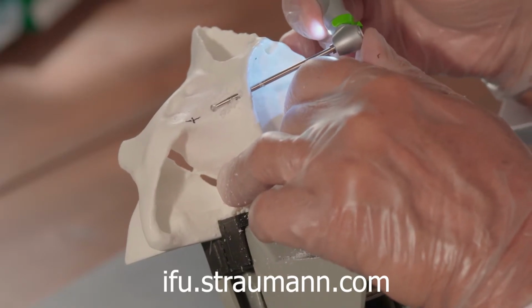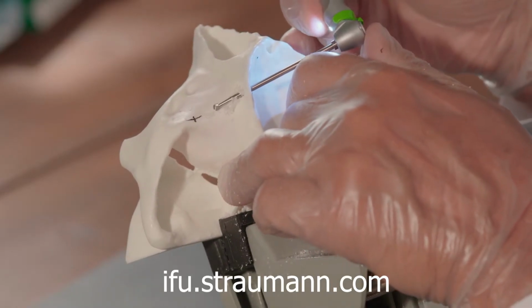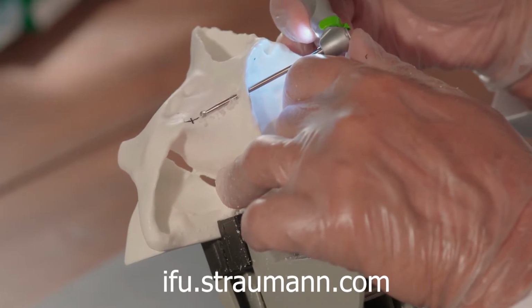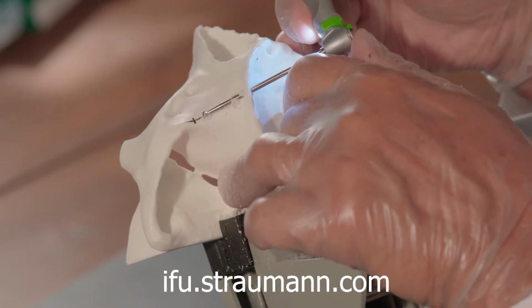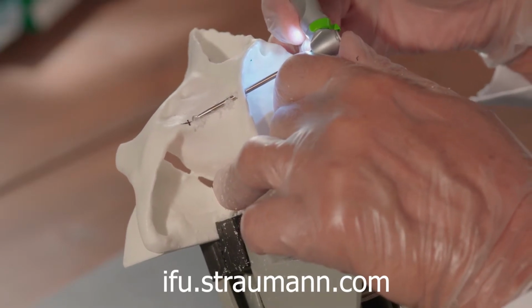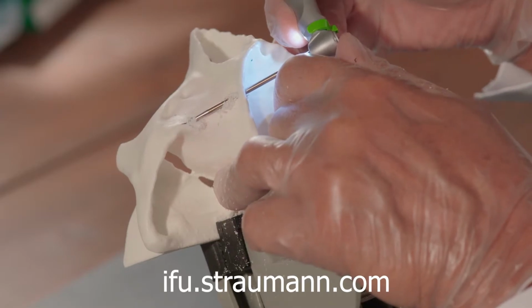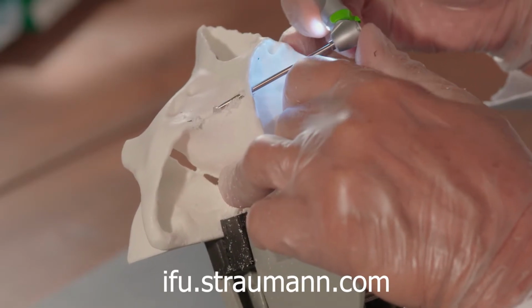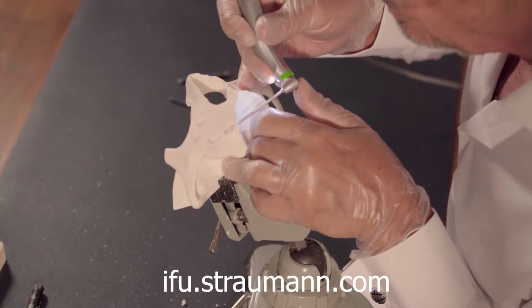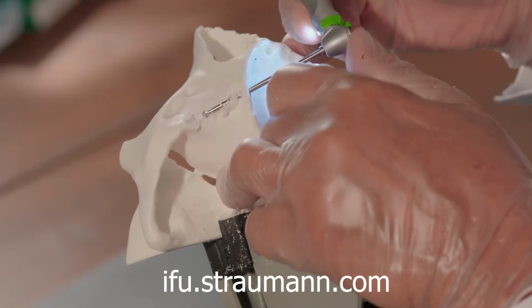Now, little by little, the tip of my drill is reaching the cross I made, so I don't get loose. And I like to get the middle of the cross with the middle of the drill, in order to be sure I will have enough bone, so the whole drill is supported by the osteotomy, and we made a nice notch.